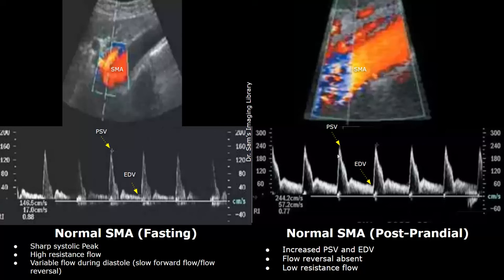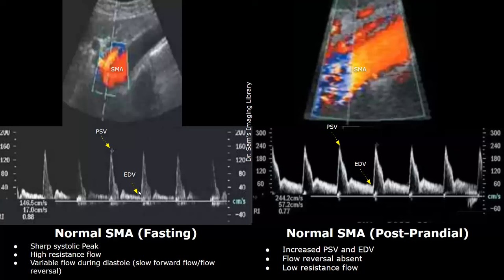During the fasting state, the superior mesenteric artery (SMA) has a sharp systolic peak on spectral Doppler. These sharp, narrow peaks indicate a high resistance flow — this type of waveform will be seen during fasting. During diastole, there is variable flow consisting of slow forward flow and sometimes flow reversal.